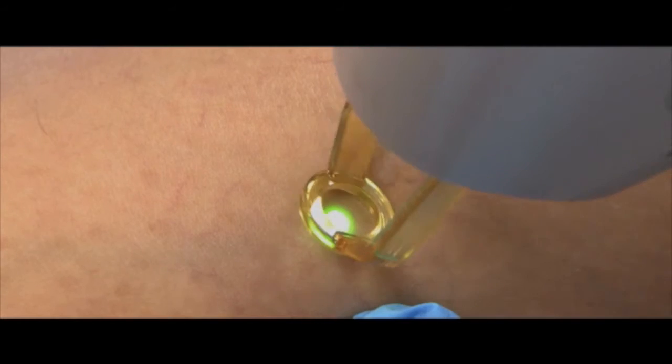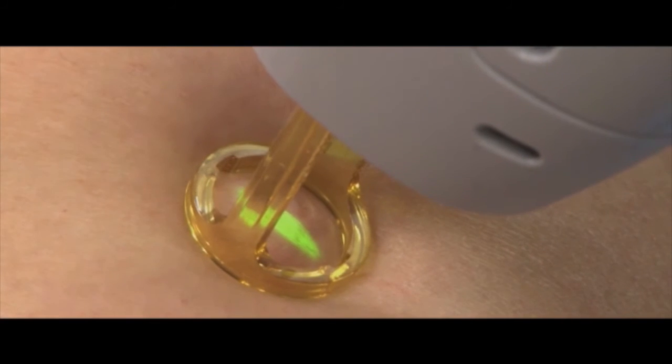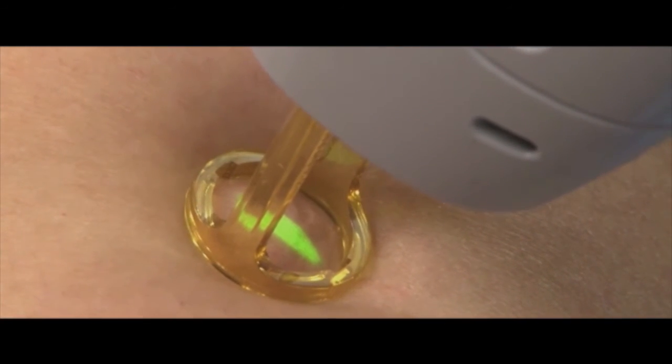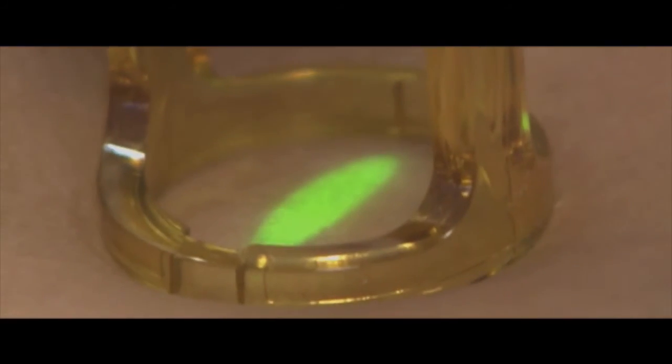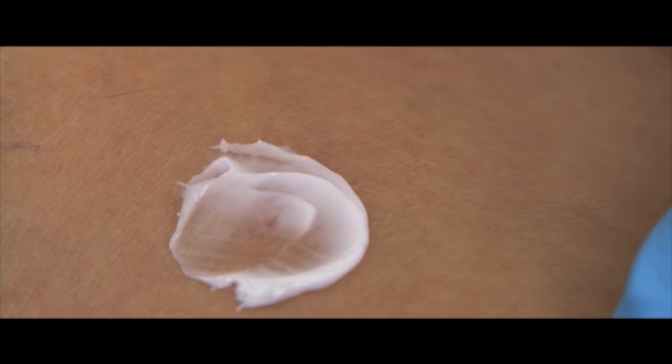When determining optimal energy settings, if you do not see any response, do not pulse over the same area until 5 minutes have passed and the area is completely cooled. The treatment endpoint is spasm and darkening of the vessel. It is also possible that the vessel will disappear momentarily. Once treatment is completed, follow the post-care instructions found in the clinical manual.